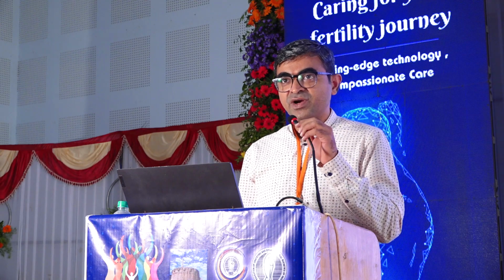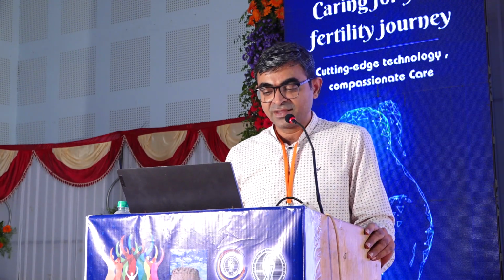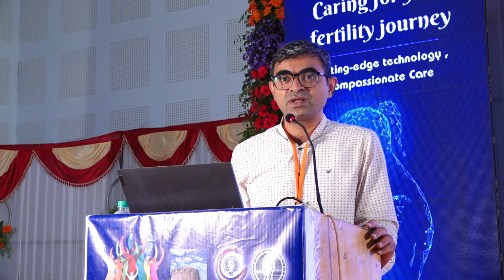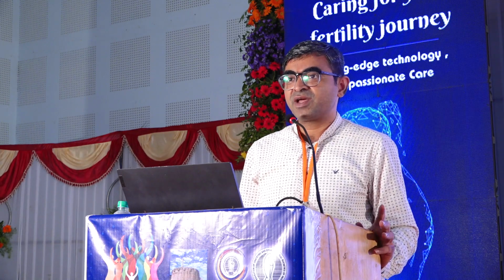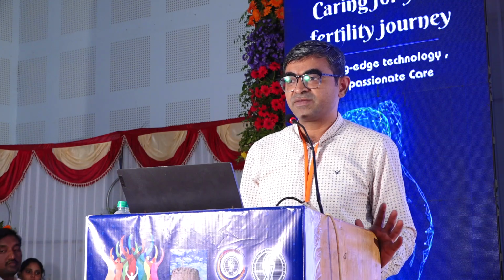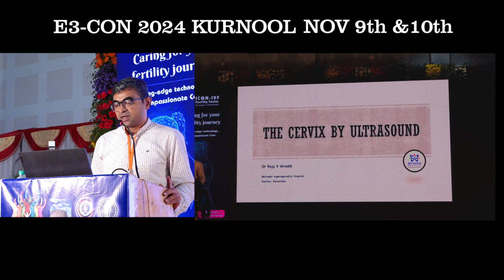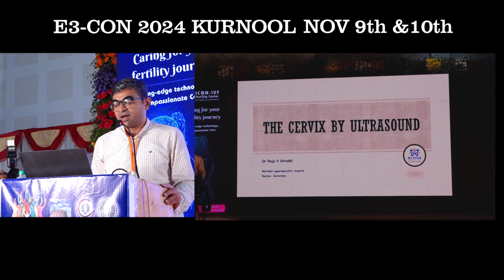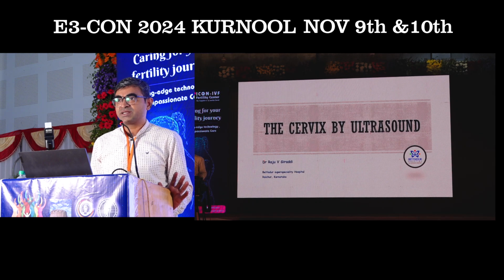In fetal medicine, when you are spanning across the fetus, if I ask which is the most neglected organ, it would be the placenta. Similarly, in ultrasound imaging, we are more interested in looking at the uterus, especially the corpus part. The cervix is usually neglected or ignored most of the time. So again, I am going to stress transvaginal sonography only, because that is what gives me good optimization of the image.